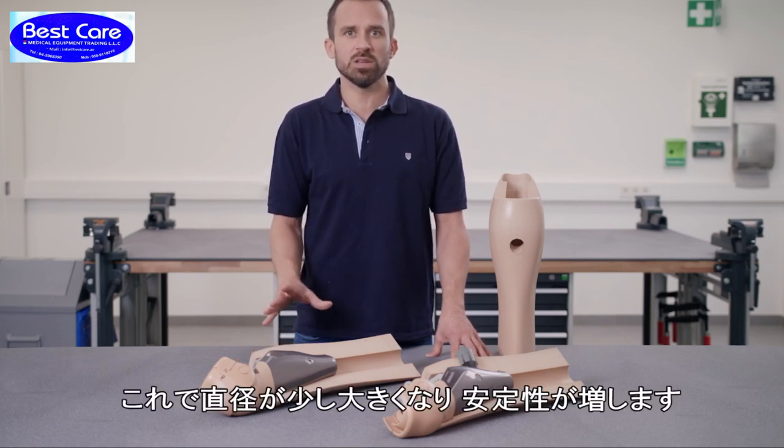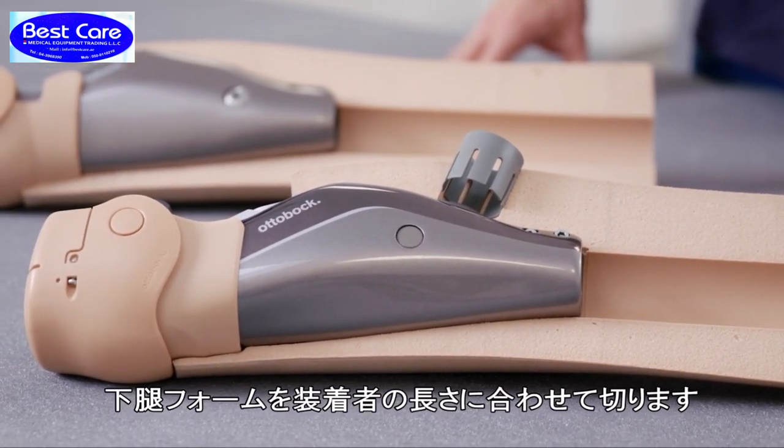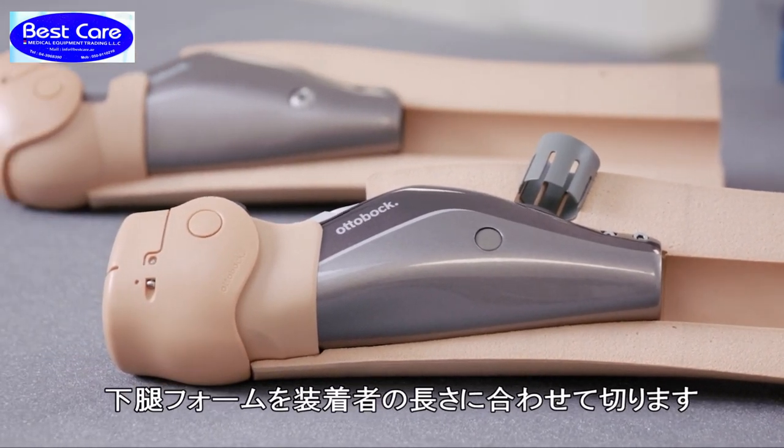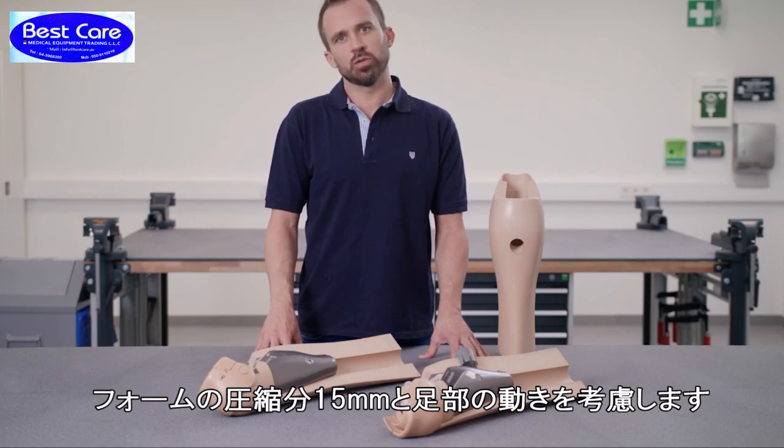Now you have a diameter that is a bit bigger and offers greater stability. The shank is now shortened according to the user's measurements, taking into account a compression measurement of 1.5 cm and the foot position.